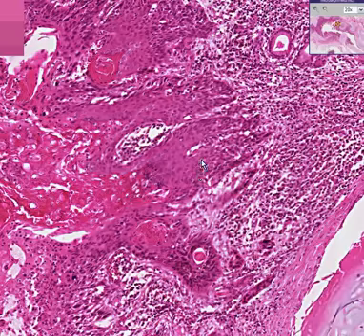If, on the other hand, you didn't see bridges and you didn't see pearls, and all you did was see nests of cells that kind of look squamous, but not very much, they certainly wouldn't be forming glands, then you could call it poorly differentiated squamous cell.